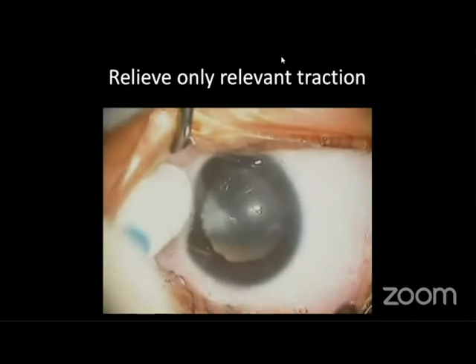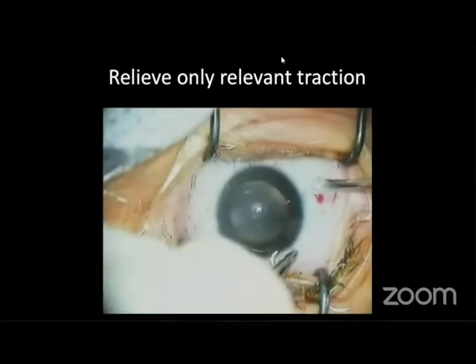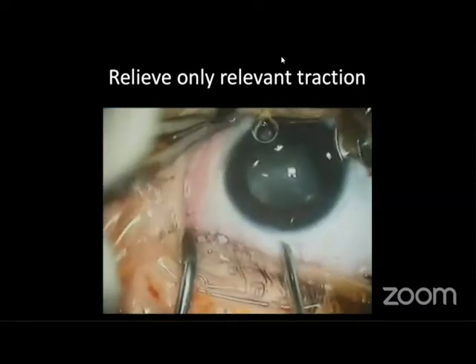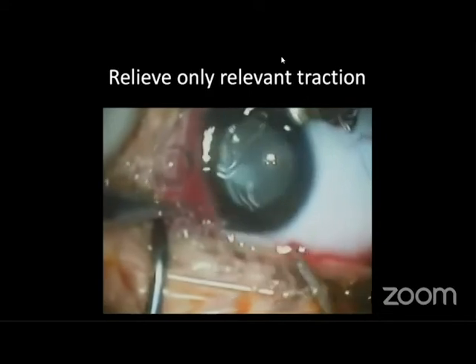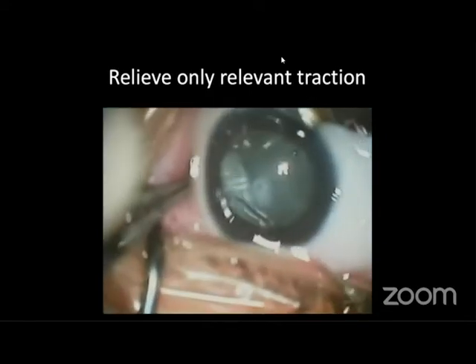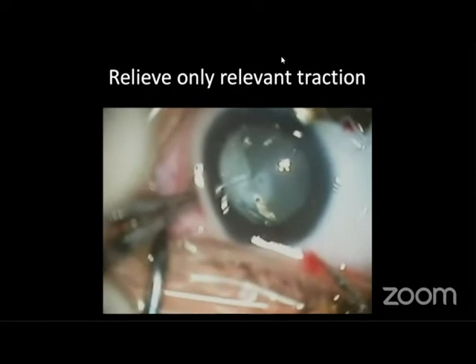In select cases, we resort to what we call minimally invasive ROP surgery. This is for cases with a localized area of traction retinal detachment, as in this patient, where the proliferation and traction retinal detachment is essentially nasal, because of one area of fibrous tissue dragging the retina anteriorly. From the ridge, the proliferation can extend to the lens, and there is also loop traction.